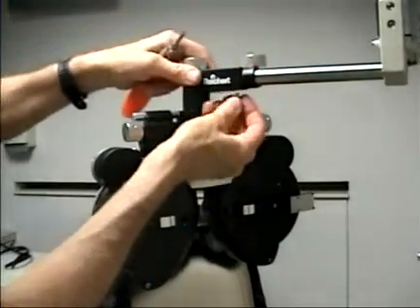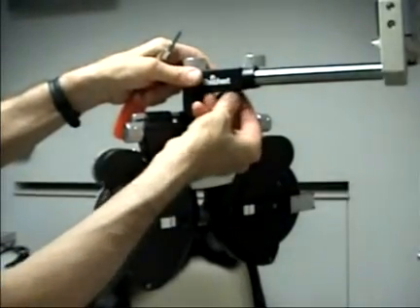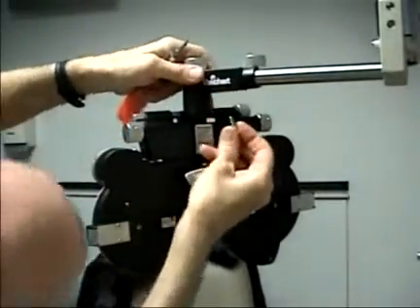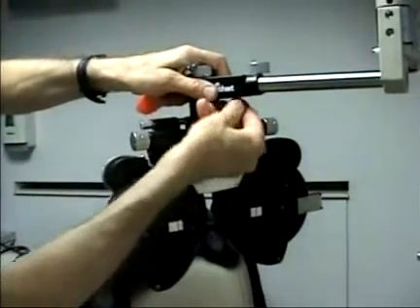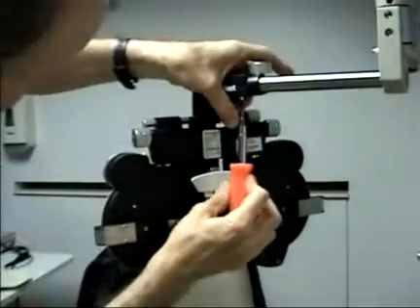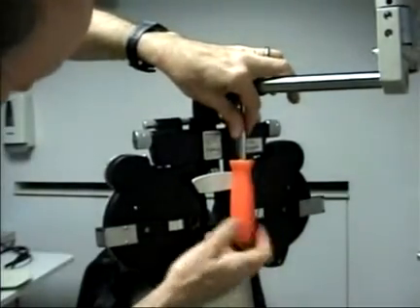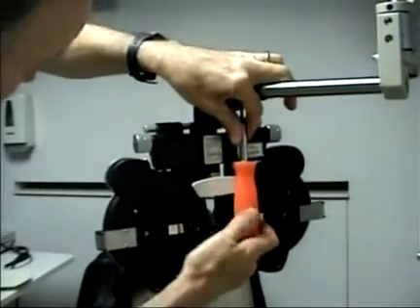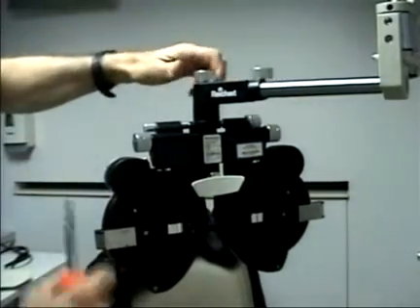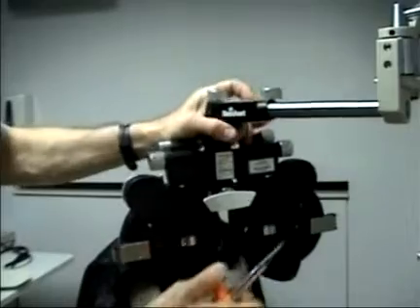Removing the phoropter is done by first removing the set screw that fits inside the phoropter arm. There's a slot underneath this section of the phoropter arm which allows a screw to be inside here. So when you remove or replace the phoropter, the set screw should be removed first. Without this set screw, if you happen to loosen the knob by mistake, it could slide right off the pole. But with the set screw in place, it's not going to go anywhere.